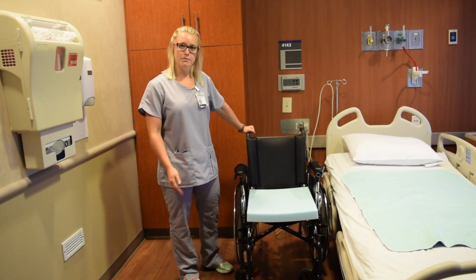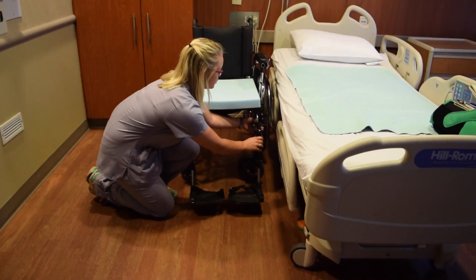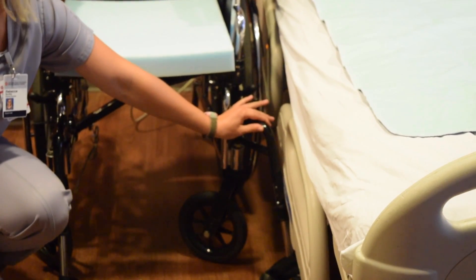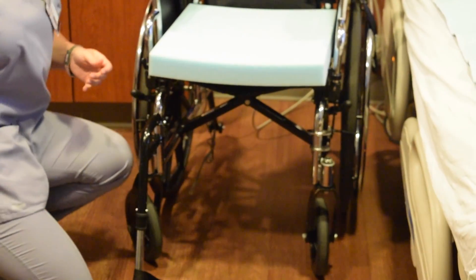When preparing to transfer a patient from wheelchair to bed, there are a few things to keep in mind about the wheelchair. First of all, the leg rests are removable. If a leg rest is too close to the bed and will be in your way, before you get the chair that close, you can simply lift up and remove that footrest.